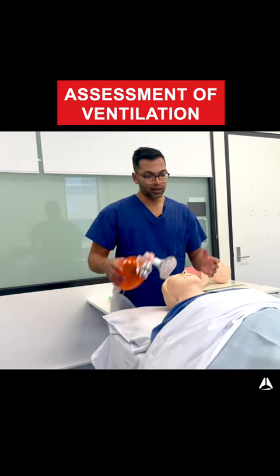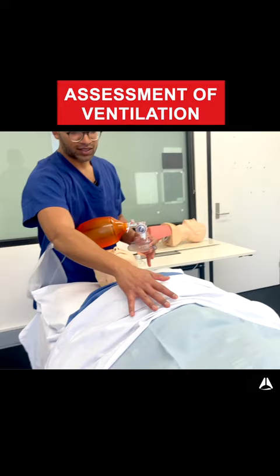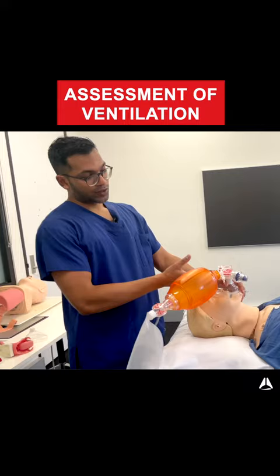I'll be monitoring for symmetrical rise and fall of the chest, making sure that I'm not seeing obstructive, seesaw, or paradoxical breathing — which means the diaphragm is contracting but there are obstructions, so you get chest wall recession. Another indicator is fogging of the mask, which you may see as the patient exhales.